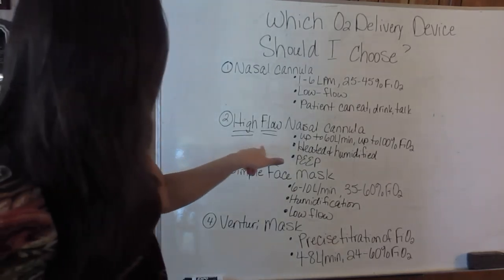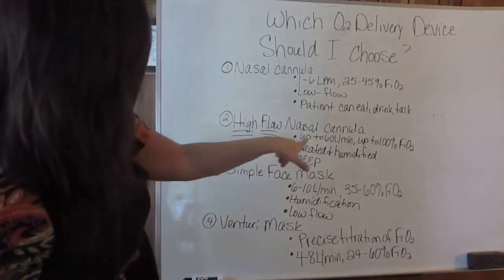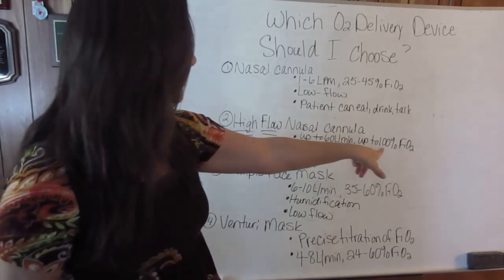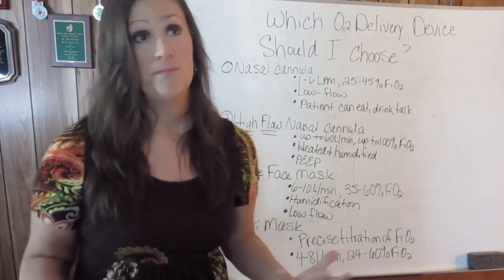Obviously, by the name high flow, it's a high flow device. We can set a flow rate of up to 60 liters per minute, and that's going to give the patient anywhere up to 100% FiO2.